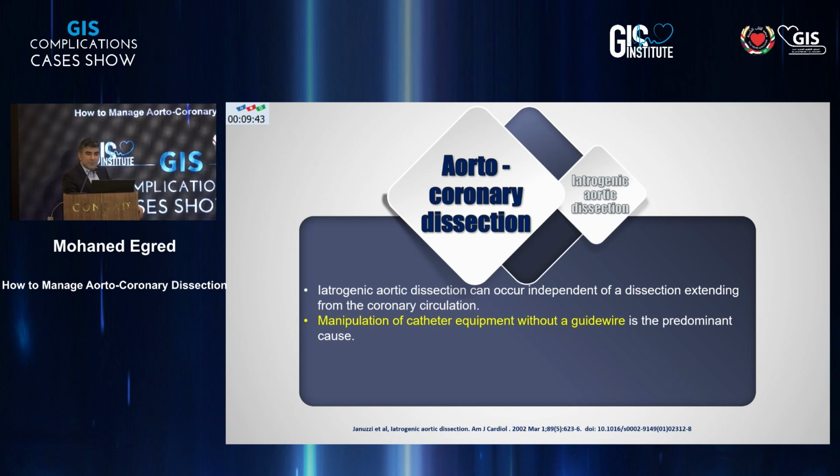This was a lady of 83 years old, really small aortic dimension and so on. Anyway, she ended up going for a post-mortem, and what the post-mortem showed was a dissection, a spiral cut in the root of the aorta. And when you go back and look at the angiogram, because we discussed all these cases back, you could see the AL1 moving around until it cut into the right coronary artery.